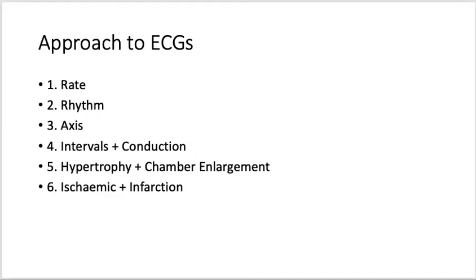This is not going to be a very encompassing lecture that explains what causes the changes in rate, rhythm, or axis deviation, as there are so many different things that can cause any pathology or changes from the normal. It just won't fit in this kind of lecture. Instead, this will help you work on these techniques to recognize those changes so that when you go out and practice reading ECGs on your own time, as I know everyone's going to do on these quarantine Saturday nights, you can determine what those changes are, and then from real-life practice, see the changes and determine what pathology is specific to each ECG you're looking at. All right, so let's just jump in.